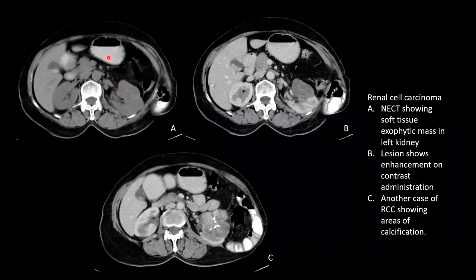This is renal cell carcinoma. NECT shows a soft tissue exophytic mass in the left kidney. The lesion shows enhancement on contrast administration. This is another case showing areas of calcification in a renal cell carcinoma.